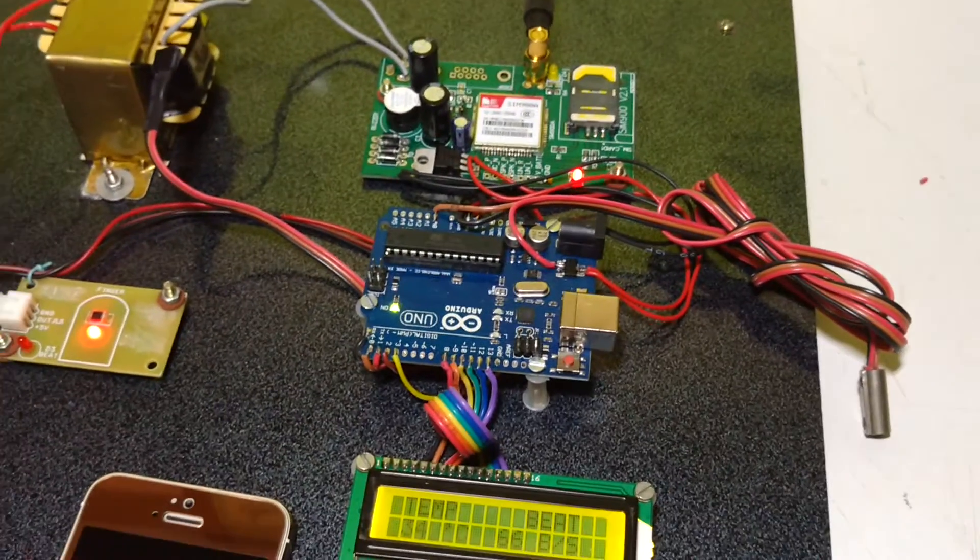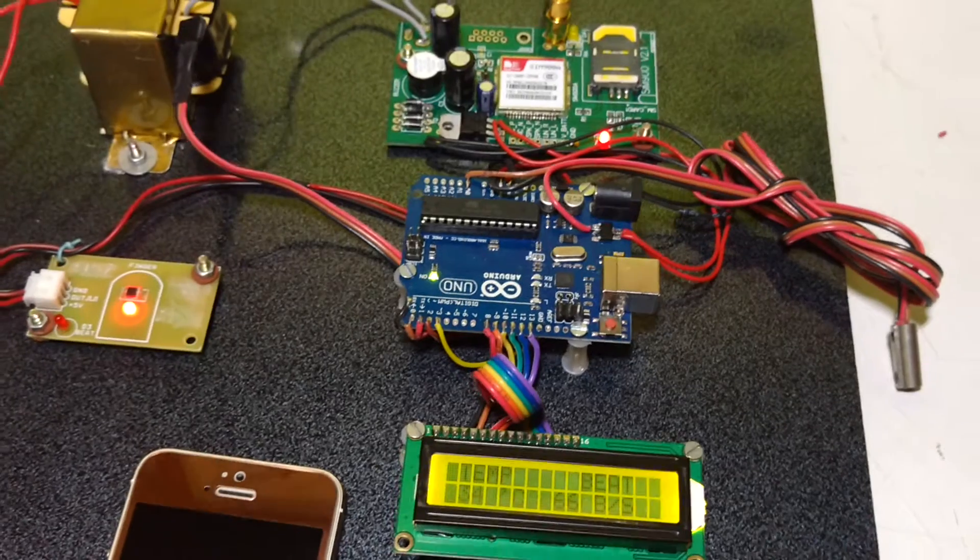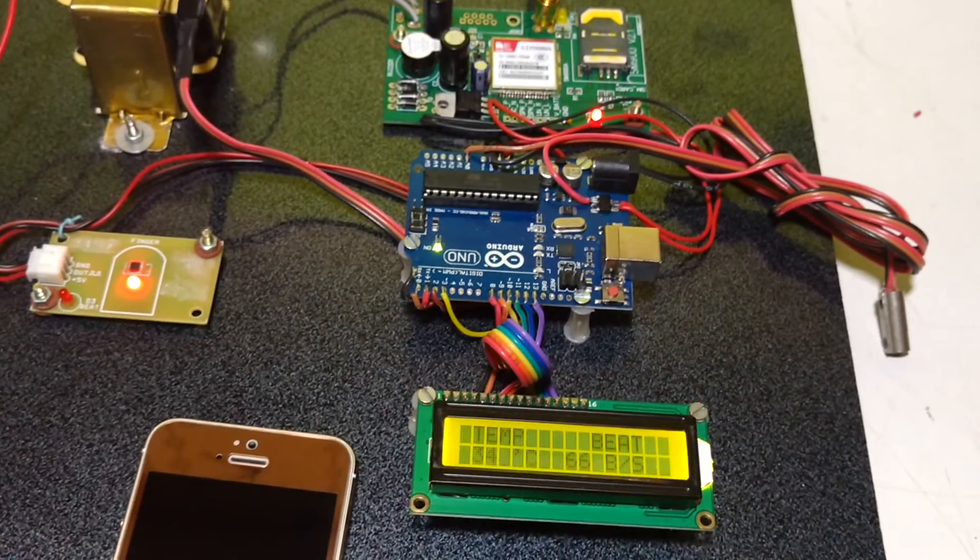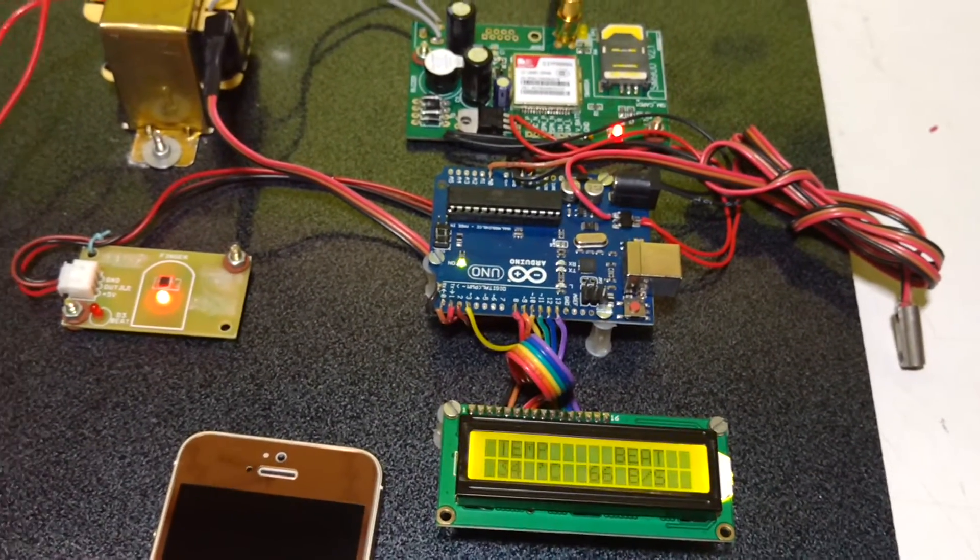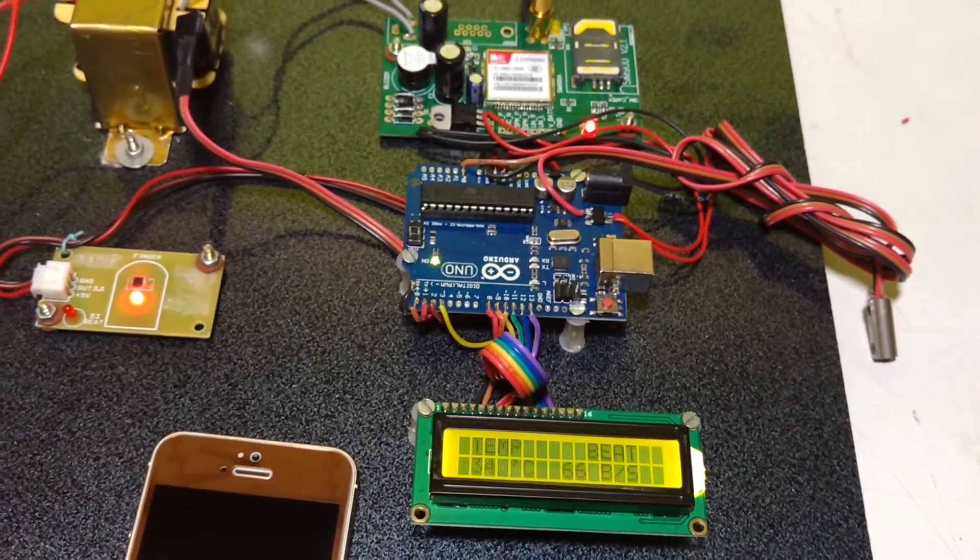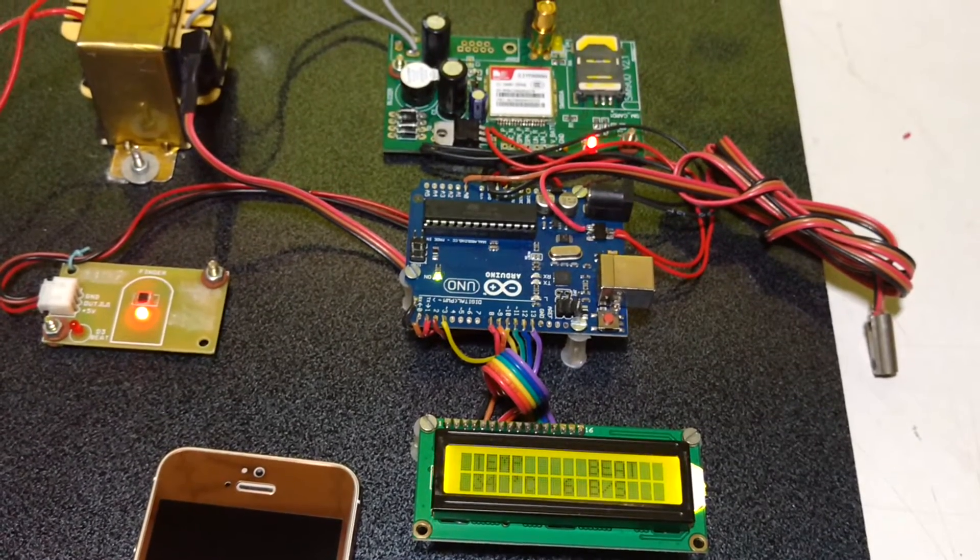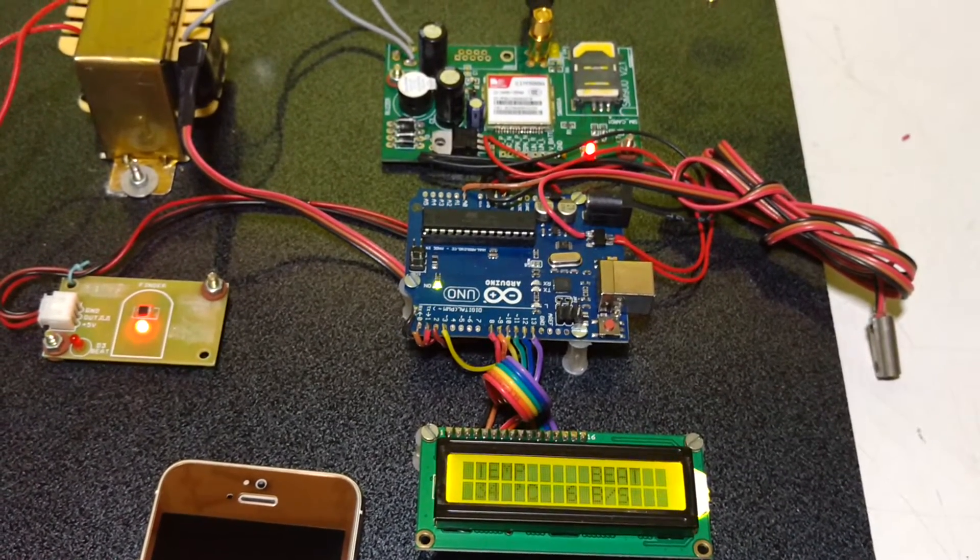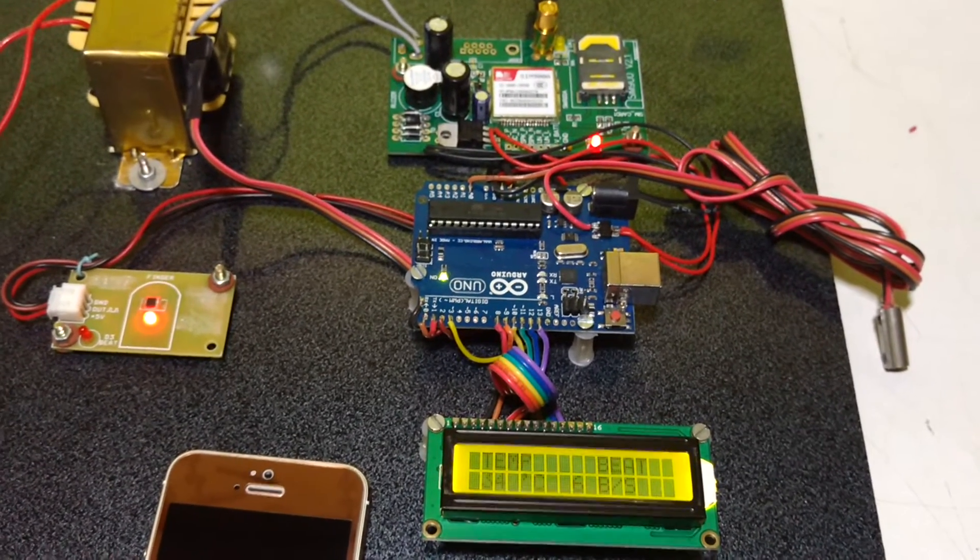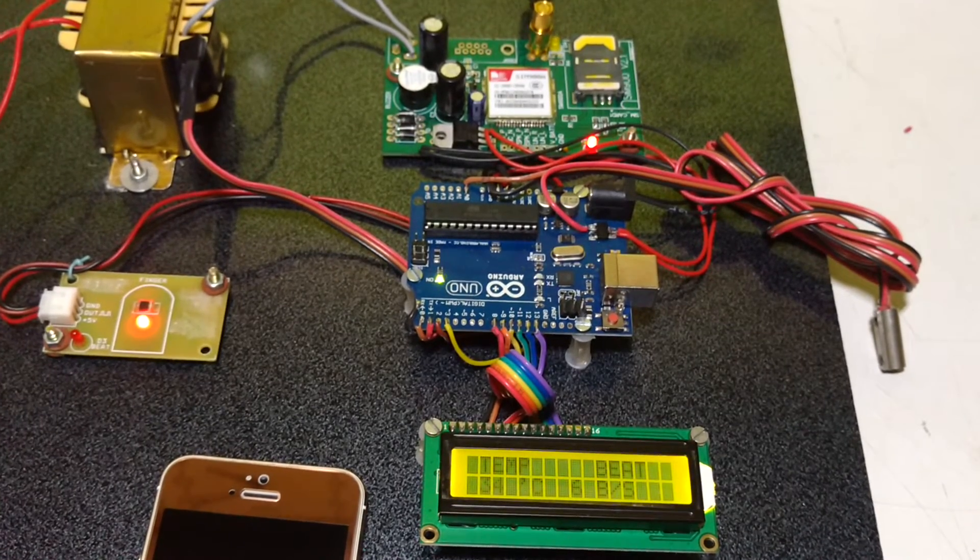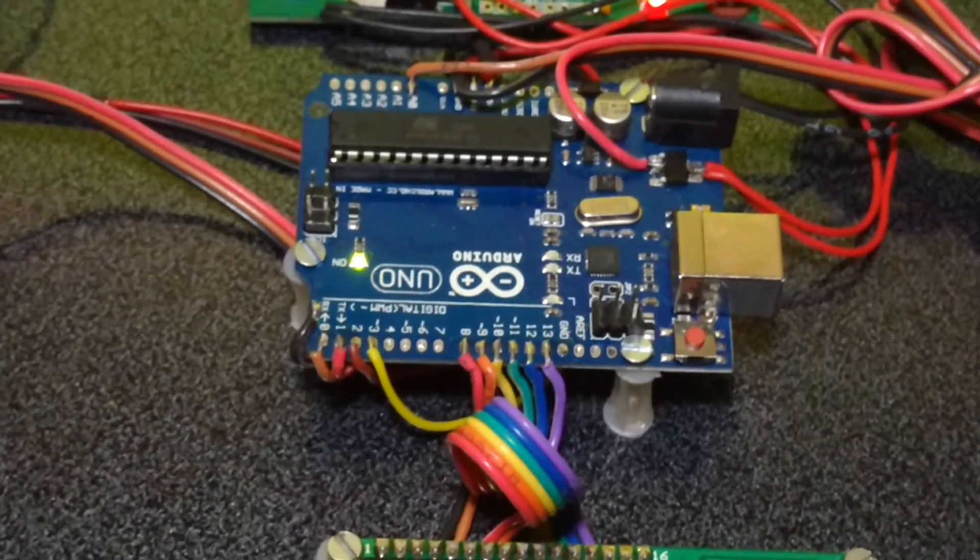In interrupt pin digital 2, which is interrupt 0, it is monitored by a program ISR, means interrupt service routine, which will count.